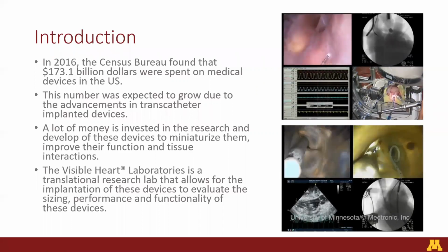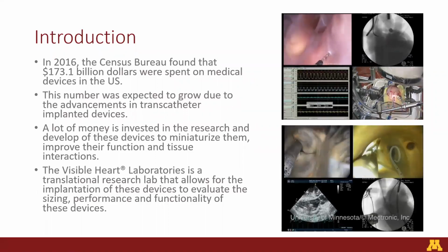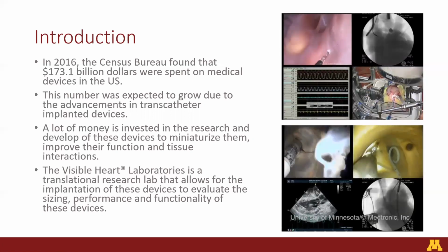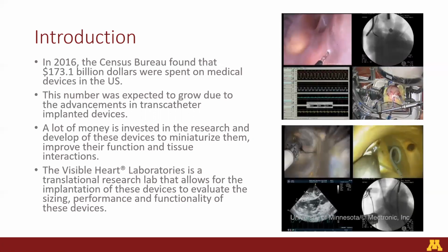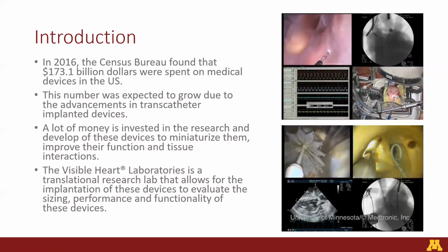While the heart is reanimated, we are able to visualize implantation of various cardiac devices such as pacing leads and transcatheter aortic valves like the ones shown here. Above we have a pacing lead and below we have the transcatheter aortic valve. During this process, we're able to observe how the device is implanted, how it functions, and more importantly, how the heart functions after implantation.